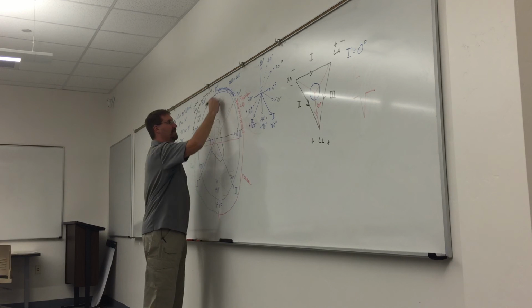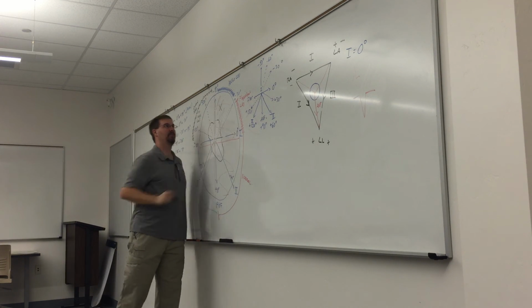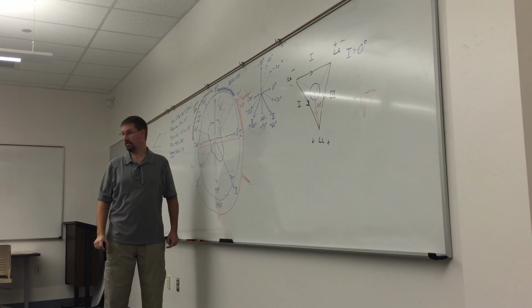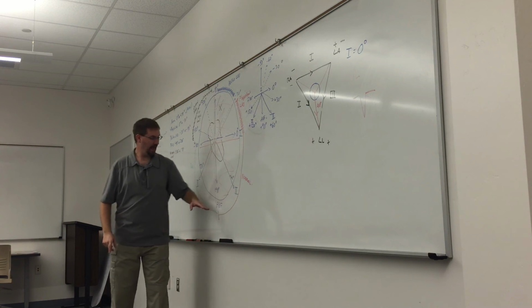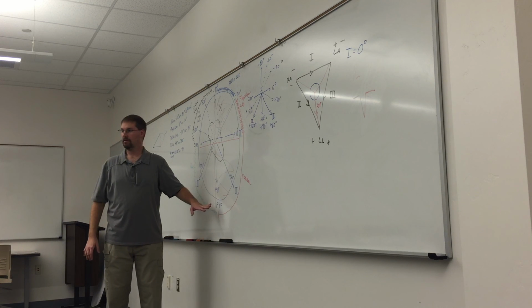So what is the axis? Pathological left axis. It has to be pathological left axis deviation. You guys see that? So you only used one, AVF and 2. One AVF and 2, yes. Okay. That kept you on that side.